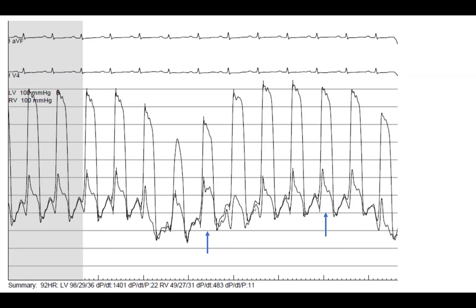Does everybody understand that? The two features: you have to look at the pulse volume, not the peaks, and you have to pick the peak inspiratory beat and peak expiratory beat based on the diastolic dips, which help you tell which are the peak inspiratory and expiratory beats.